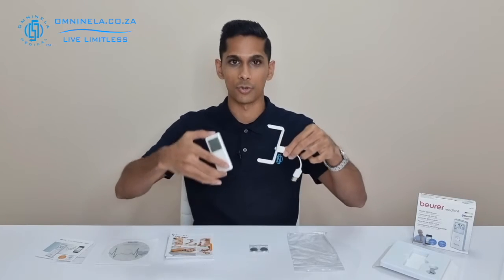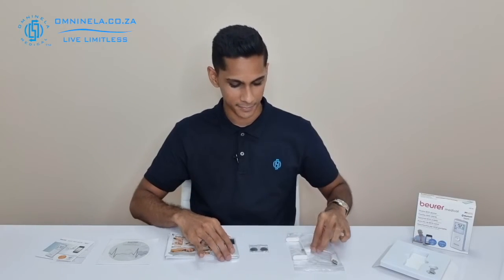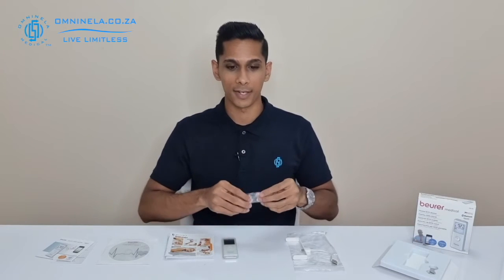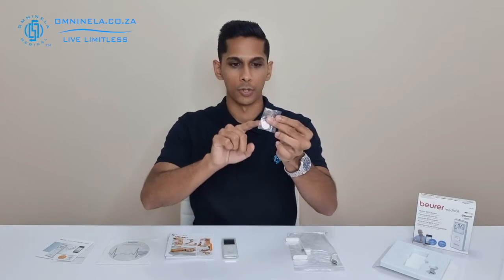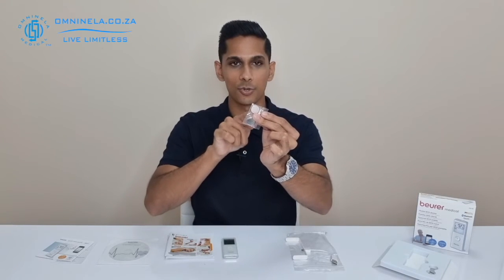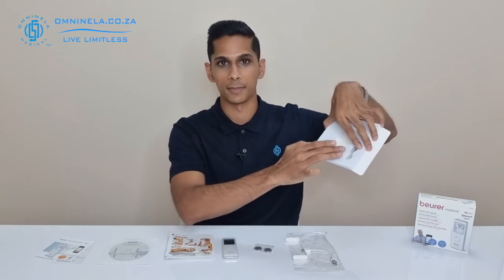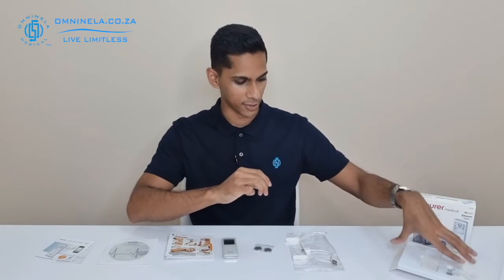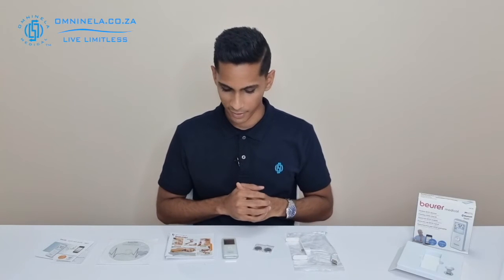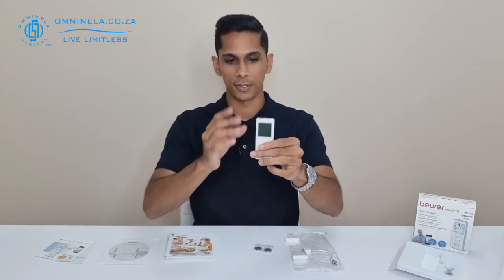We've also got our USB docking station and cable, which will allow you to connect into the device itself and export data over to your computer. This device is battery operated, so we've got our two 3-volt CR2032 batteries here — one set, and also a replacement set that comes inside the soft case found inside the packaging.